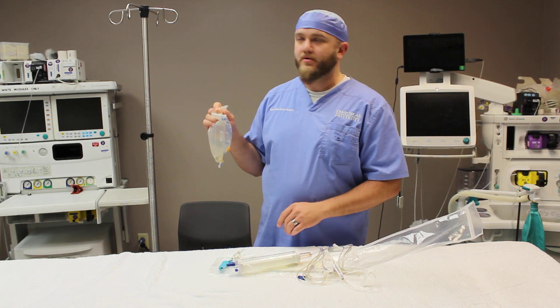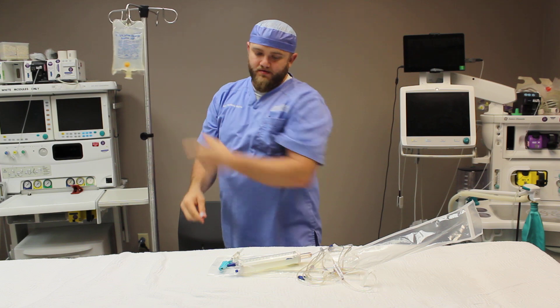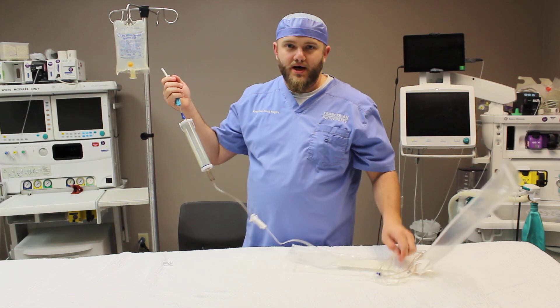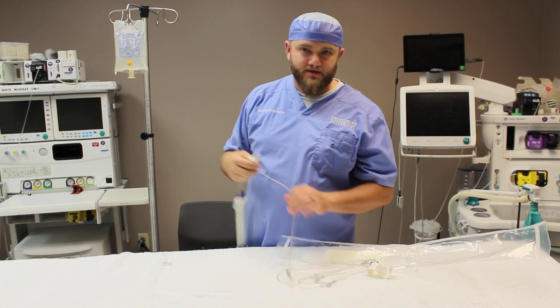For this video, we're using a standard 500cc bag. You can choose any fluid that you desire based on the case you're doing and the patient's needs. If it's a long case, you may actually need a liter bag, but for most cases a 500 will suffice.